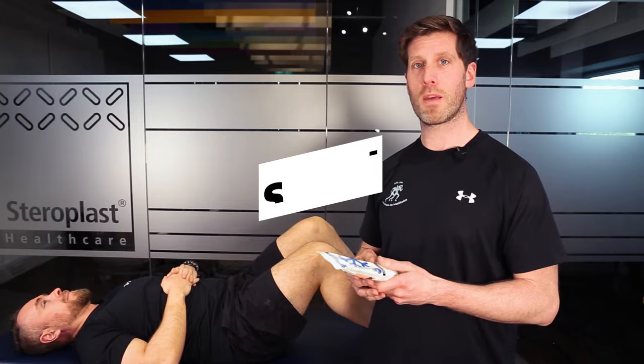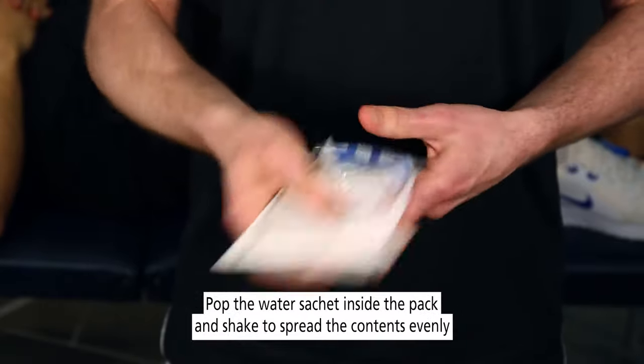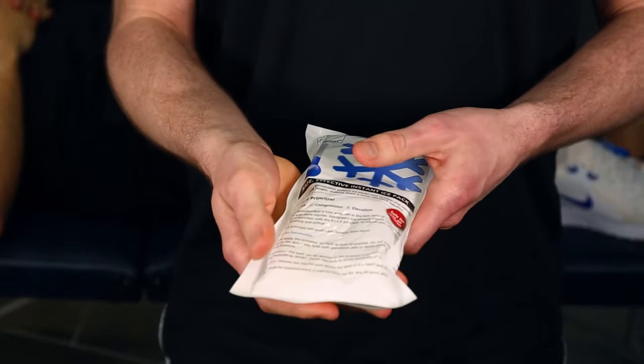Step one: find the water sachet inside the pack and squeeze as hard as you can to release the contents. Then shake the bag to release and get everything spread out, ready to use.